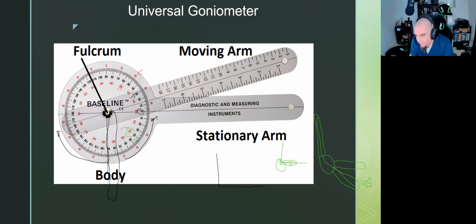And that's where you got to go, oh, well, that doesn't make any sense. That's kind of crazy. Why would they? Yeah, it's the back azimuth, exactly. So you've got to kind of think, and that's why the visualization and estimate is important. So if you look and go, oh, I think they've got, so let's look at my wrist here. There's the neutral for my wrist. I'm going to extend my wrist back.